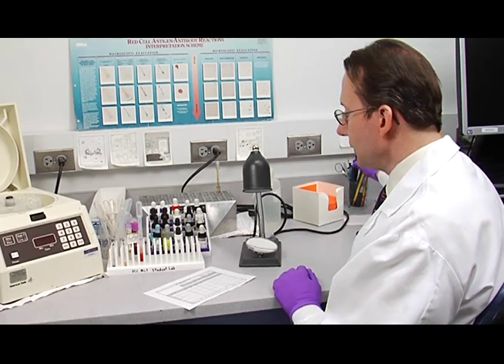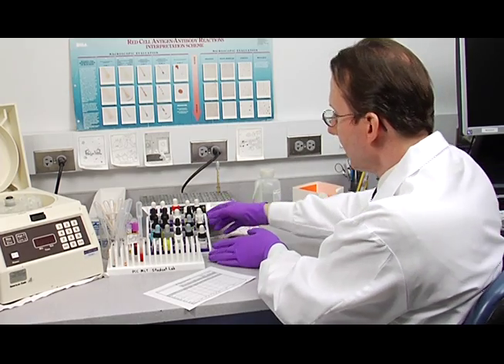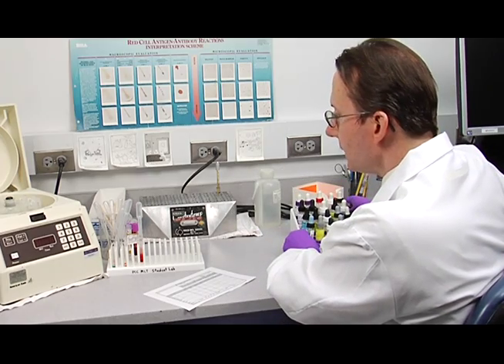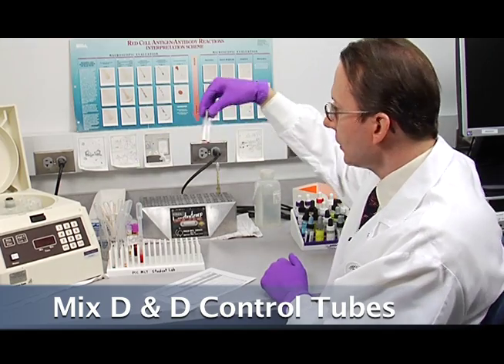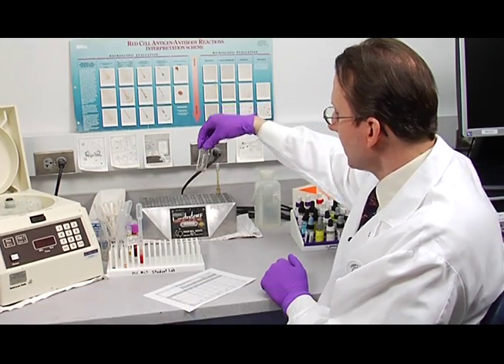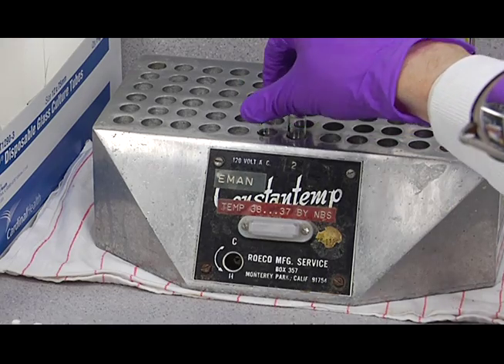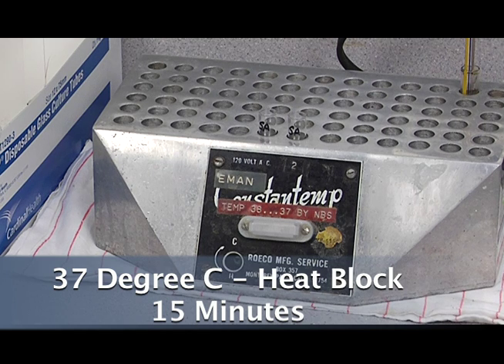Now I'll show you how to do the weak D or DU typing. The first step to that procedure is to take your D tube and your D control tube, mix them, and place them in your 37 degrees C heat block. You need to incubate for 37 degrees C for 15 minutes.